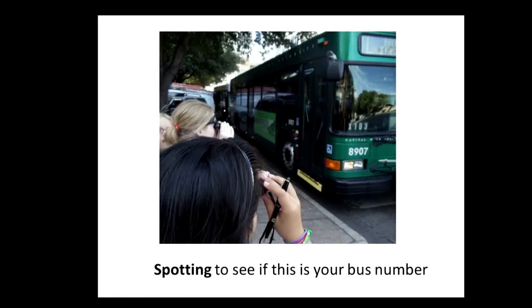"That's got too many numbers on it. I know it's not the number 5." So it became this challenge of who can guess which one's going to be our bus, and then picking up the telescope and saying the exact number. So with all the wait time that we had on a bus that happened to be late, we were turning it into a very busy telescope activity.